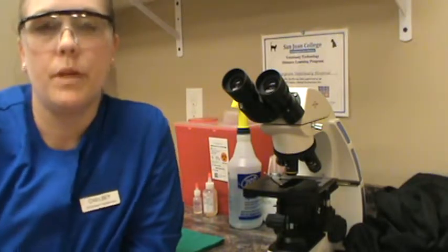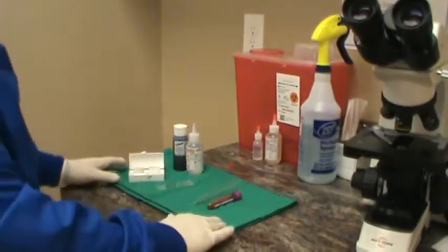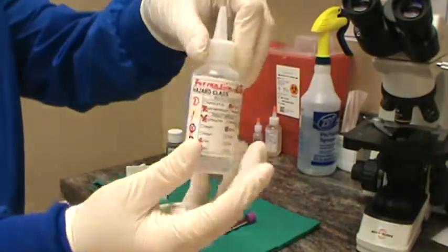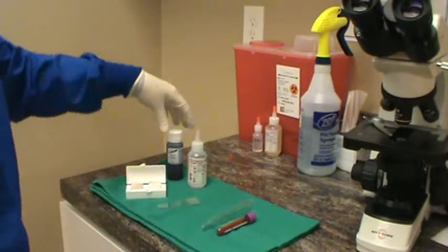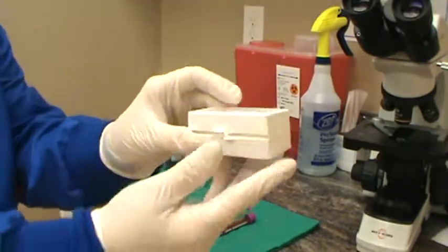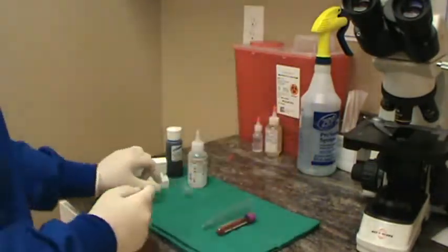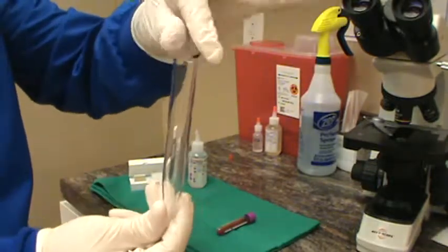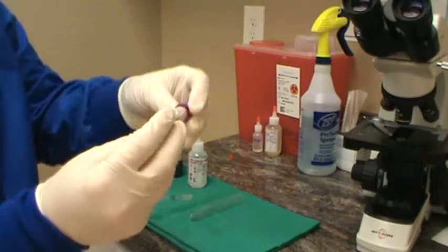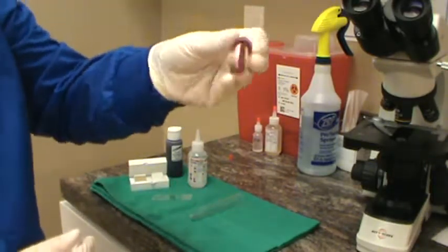First I'm going to show you the sample and our supplies. We have a tray with 2% formalin solution properly labeled in a secondary container, new methylene blue for staining, cover glass, a microscope slide, a 15 ml centrifuge vial, and 1 ml of anticoagulated EDTA blood for the patient sample.